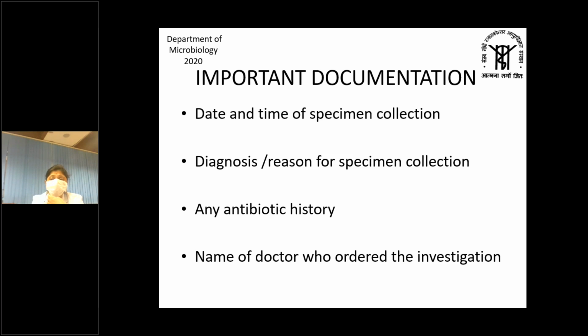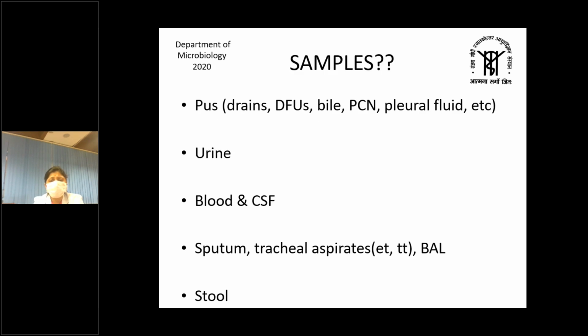Always remember to collect a sample before starting the empirical antibiotic therapy. This is because we all know that antibiotics will kill the organism or decrease the count of the organism, and the possibility of culture becoming positive becomes less. So collect the maximum volume of sample that can be drawn before starting empirical antibiotic therapy or any kind of treatment.